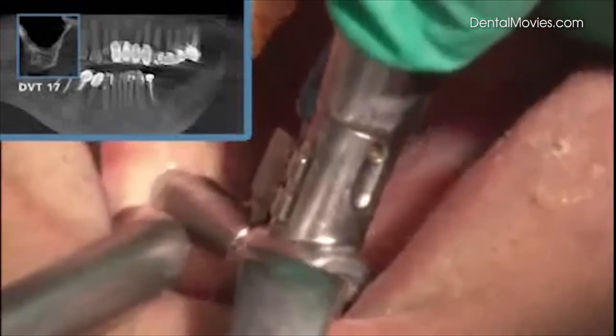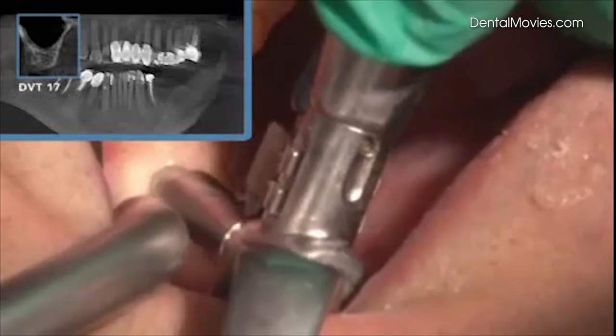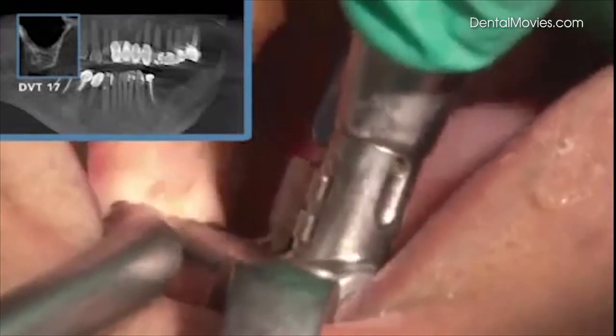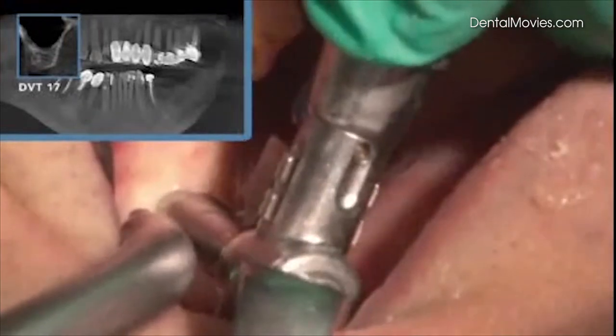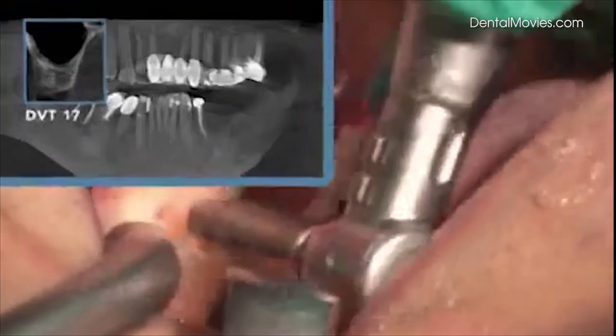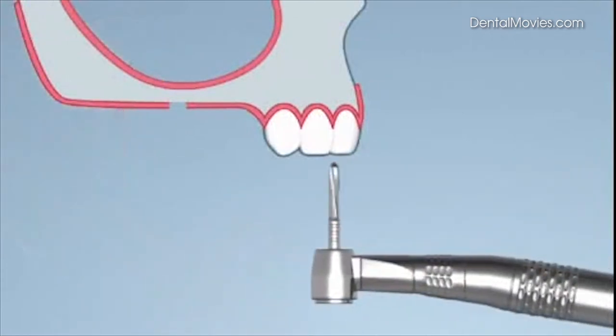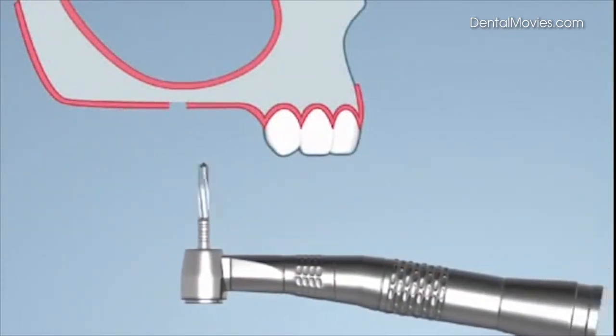Punching of the mucosa with the ATP punch developed by Professor Wolfgang Jesch. The blind hole is drilled up to 2 mm below the sinus membrane floor.